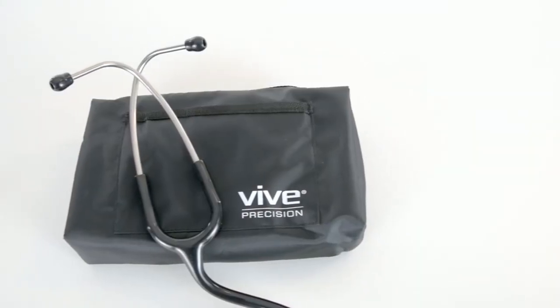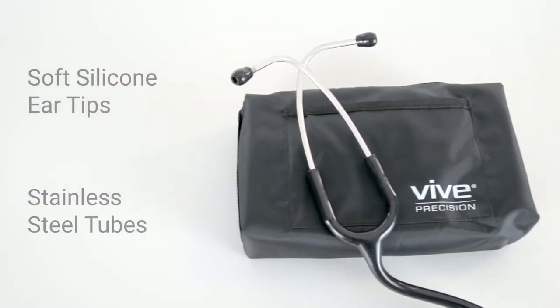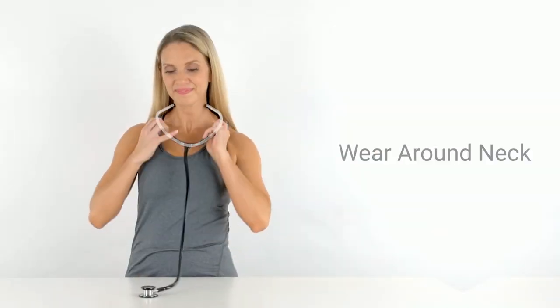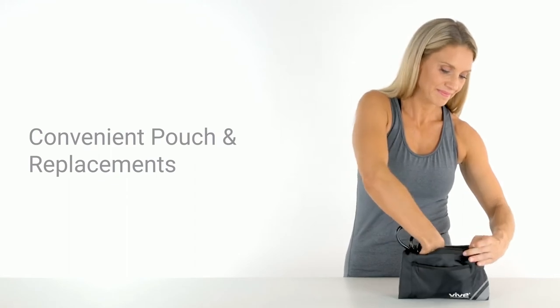The single-lumen design features soft silicone ear tips and stainless steel tubes that reduce ambient noise, ensuring sound clarity. Dual non-chill rings provide a comfortable experience for patients. Wear around your neck or store in the convenient carrying pouch along with the replacement diaphragm and ear tips.